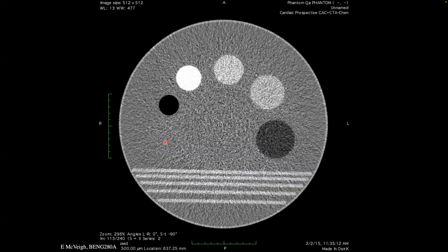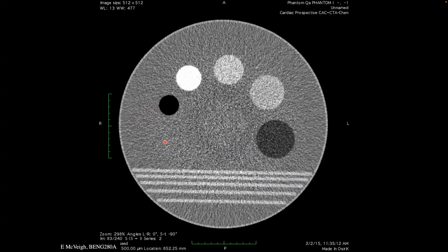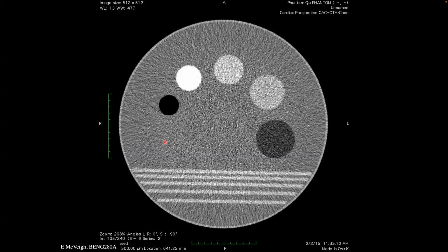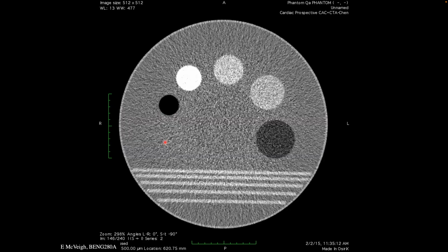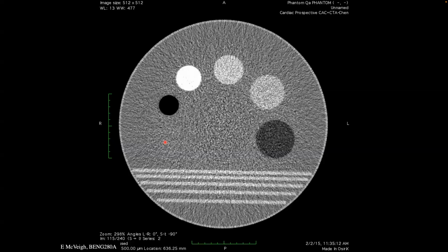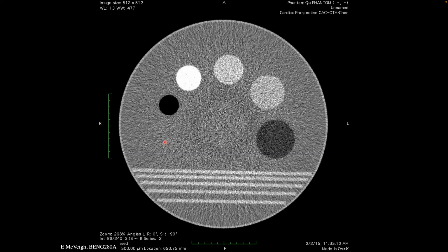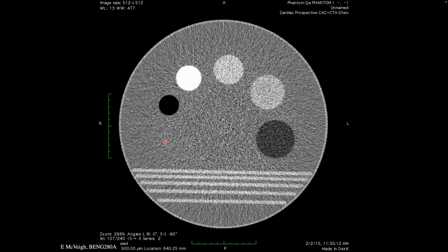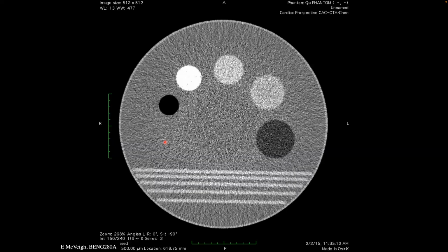That's a great question. And you can see that on occasion, it's almost like there's an explosion of circles in the middle. Like boom, right there. So there's some kind of correlation. Maybe one detector in one slice was a little funky and they had to interpolate across it, and that caused that pattern. If they didn't interpolate across the bad detector, it would be a very bad ring artifact.